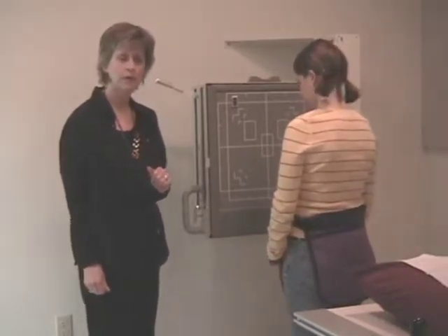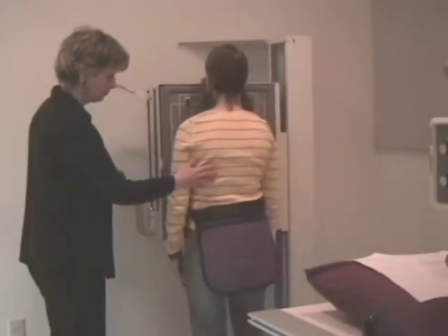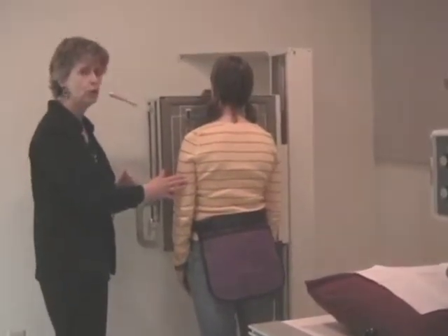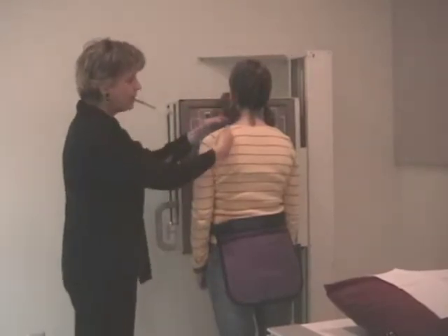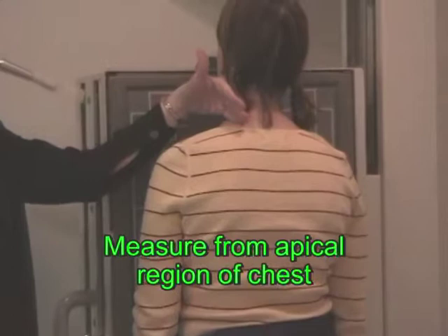So I'm going to focus on film's edge being 2 inches above the shoulder and the mid-sagittal plane to the center of the film. I'll have my patient face the unit, and when I use her shoulders, I'm going to be measuring from the apical region of the chest.